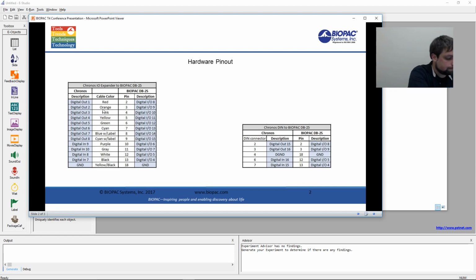So, now that I have those 2 cords, let's go ahead and set up our experiment. Now I'm actually only going to use this one since it's the simplest mode of communication and it's the easiest to show for the webinar. I'm actually just going to use the 2 digital outs. I won't be using any digital ins at this point.